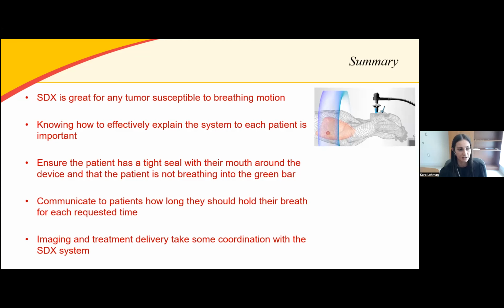And then lastly, the imaging and treatment delivery takes some coordination with the SDX system. So some parts of it might be automatic, but some parts of it are manual. So just make sure that you're only taking your images when the patient is in breath hold, whether that's the CT simulation scan or your images before daily treatment delivery.